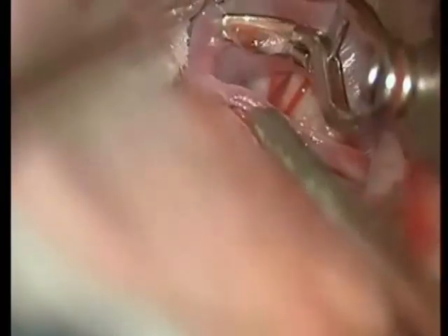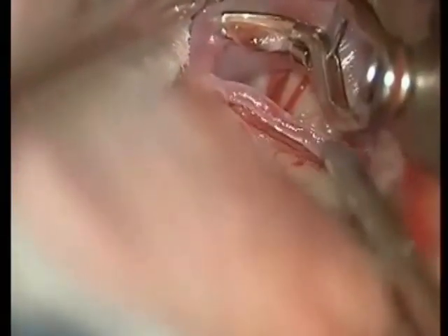The temporary clip is removed. The flow is checked with microdoppler. There is some spasm due to manipulation in the branching arteries, so we apply papaverine.